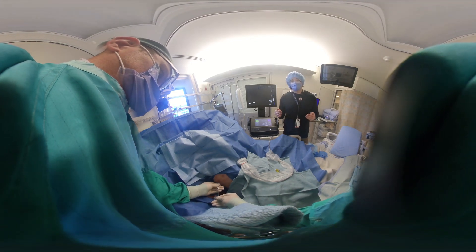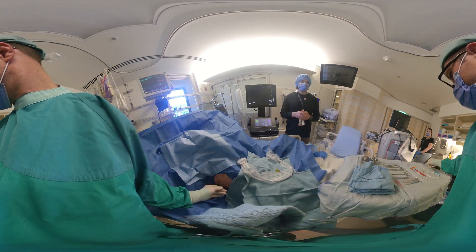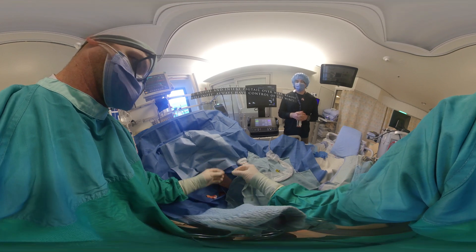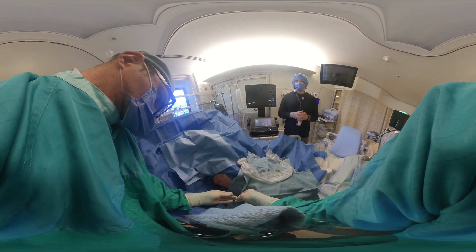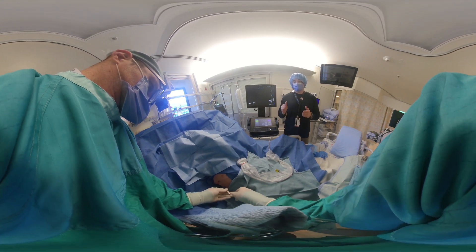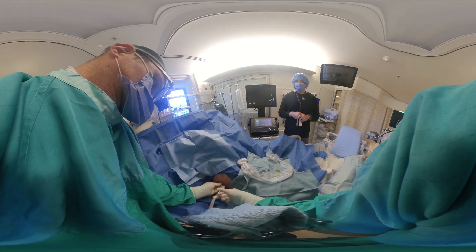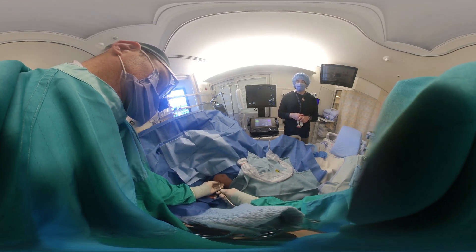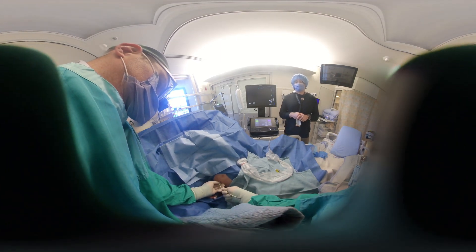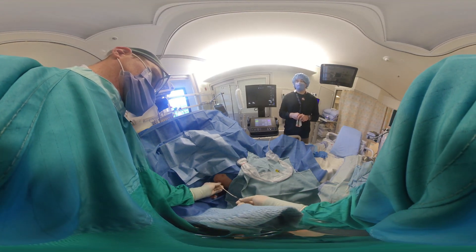Now the eight-and-a-half French pigtail will be threaded over the rigid end of the wire and passed into the pleural space. Keep watching closely to control the wire at all times — that's a really important aspect of this procedure. Thread the catheter back until you see the wire come out of the rear end, then advance the catheter into the pleural space. There should be no resistance — it should be very easy.